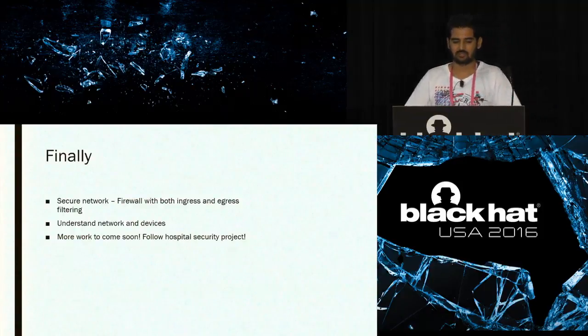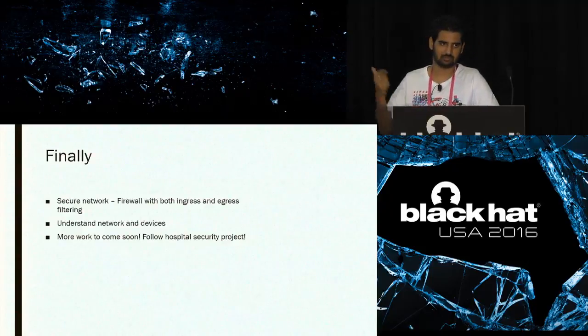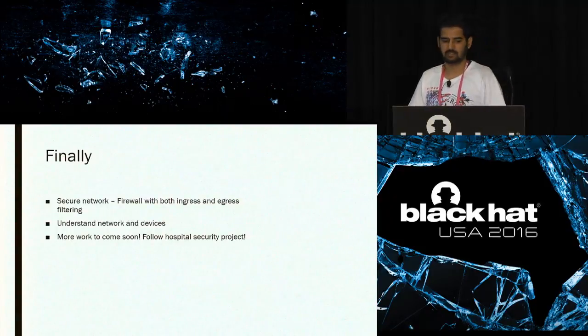Finally, secure the network with a firewall, both ingress and egress. If you go to the dark web, you can see a lot of hospital networks. So don't assume that the hospital network will not be compromised. All right. Understand your network and devices, and this is important.